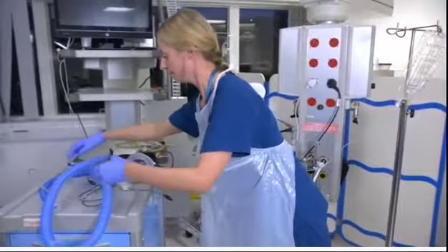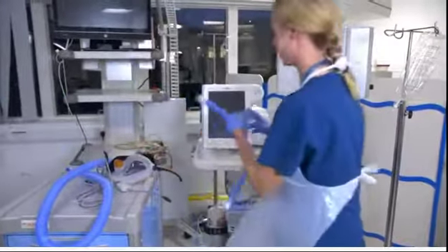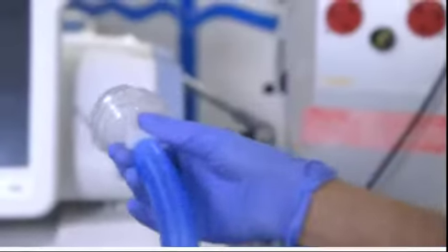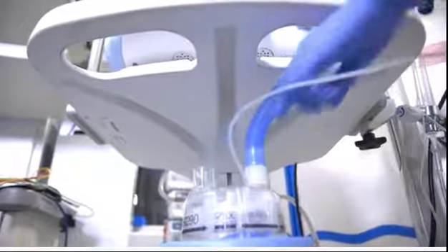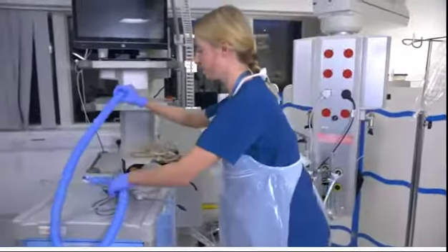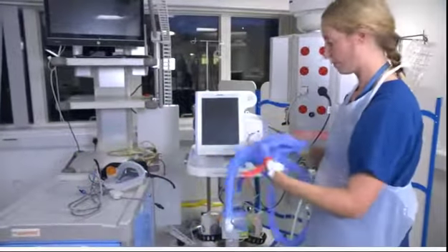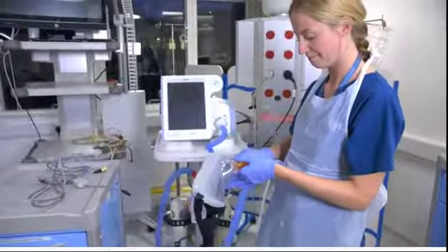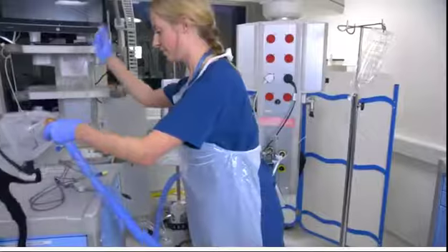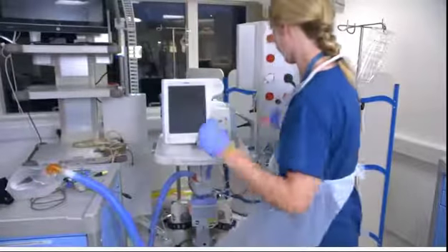Attach the bacterial filter to the circuit and then attach to the ventilator. Attach the other end of the short circuit to the humidification box. Next, prepare the mask using the larger piece of the circuit by attaching to the humidification box and place the port at the patient end. Attach an appropriate size mask and ensure the pressure cable is attached at both the ventilator and mask end.